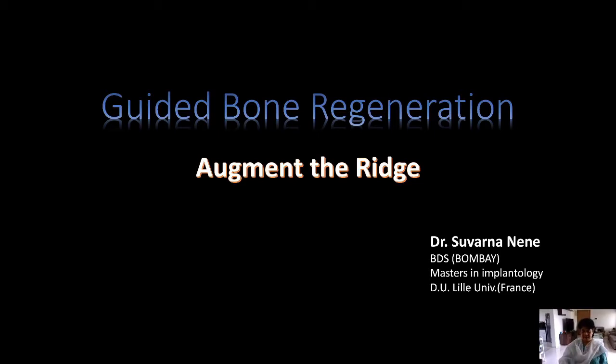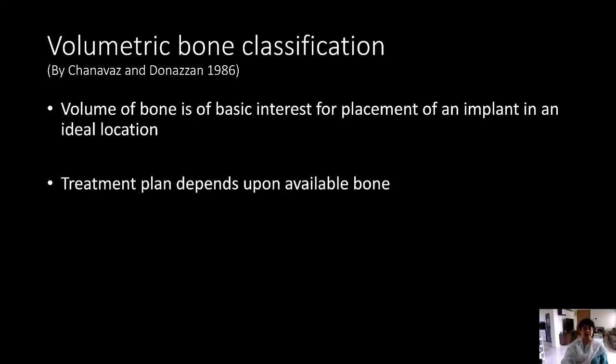Today's webinar is on the topic of guided bone regeneration, and we need to do this procedure often to augment the ridge. I hope all of you are in good health and are enthusiastic about knowing more things about the GBR procedure. Let's start with the volumetric bone classification, which I learned in France, where we always discussed the volume of bone available for implants, because it is of basic interest for placement of an implant in an ideal location.